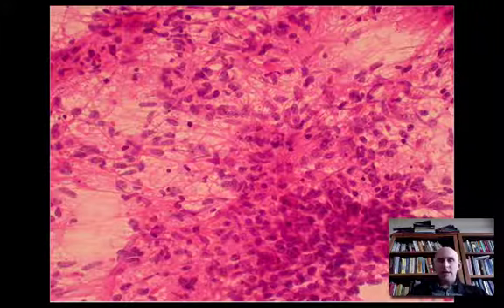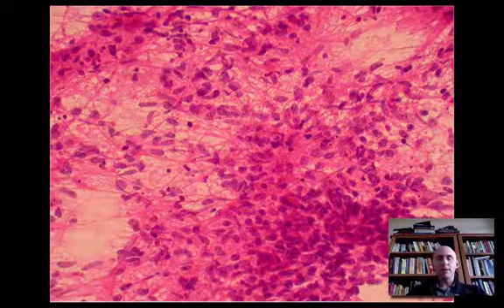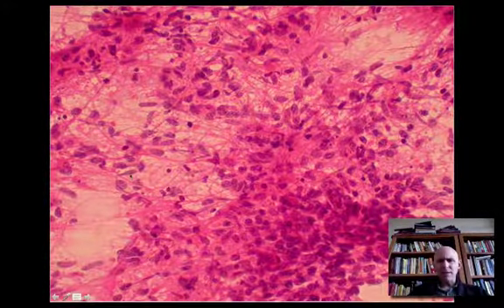This, on the other hand, is pay dirt. This is abnormal. That's our first rule, right? Make a distinction between normal and abnormal. It's abnormal. It's neoplastic. It's emphatically neoplastic. These look like they're all part of the same process. It's also emphatically glial. And you have the satisfaction of seeing real atypia here, hyperchromasia, some little tiny fragmented nuclei.